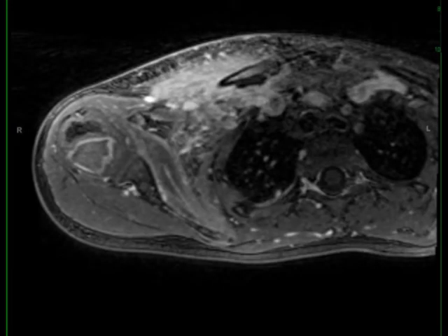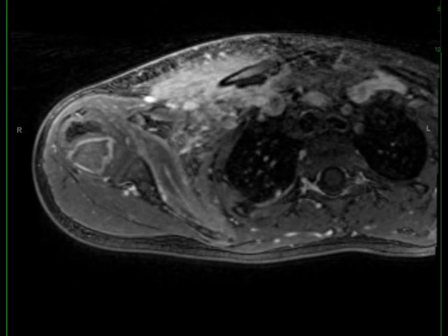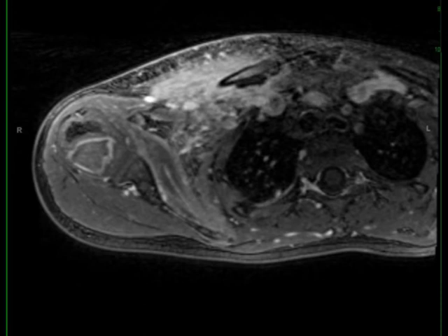There is a drainable peripherally-enhancing fluid collection at the postero-inferior aspect of the right clavicle, compatible with a subperiosteal abscess in the setting of clavicular osteomyelitis.